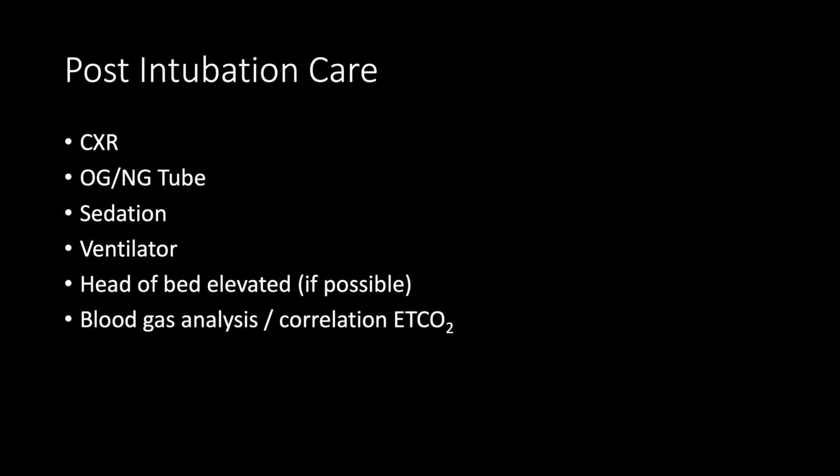Going on to post-intubation care. So we've now successfully passed our endotracheal tube, and there's a big sigh of relief in the room. Just remember that your job and your team's job is not done yet. There's still a number of things that need to happen to safely care for this patient, right?